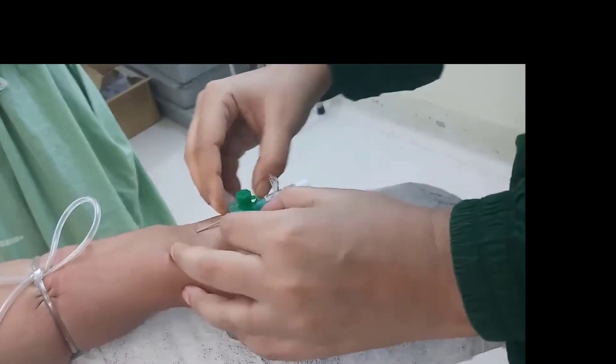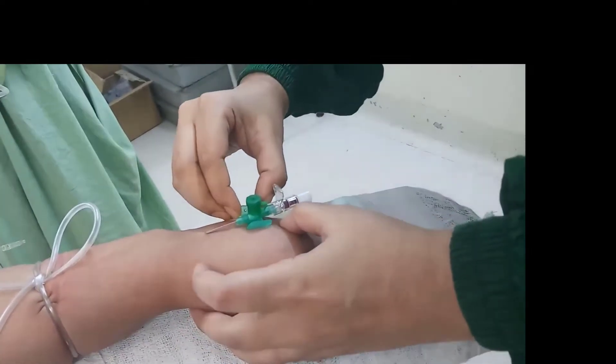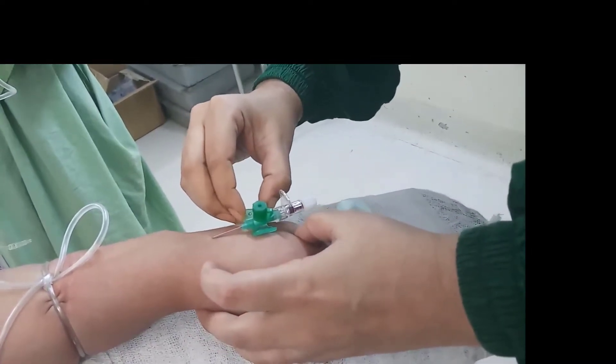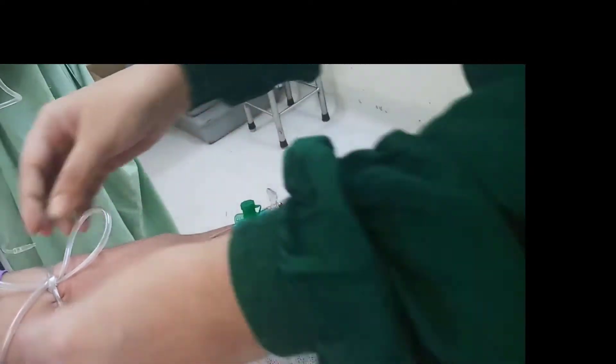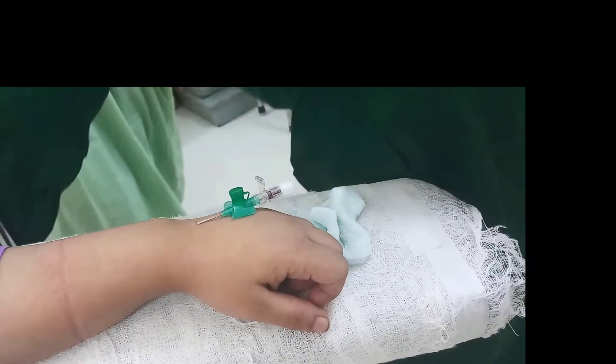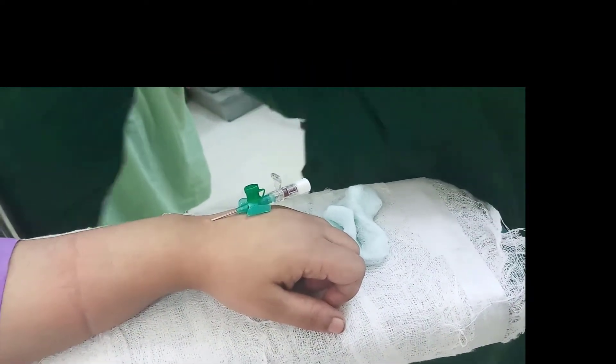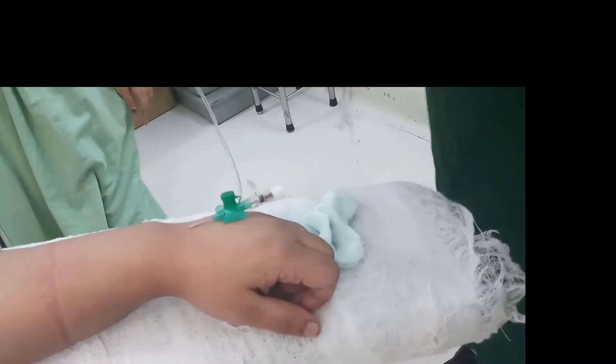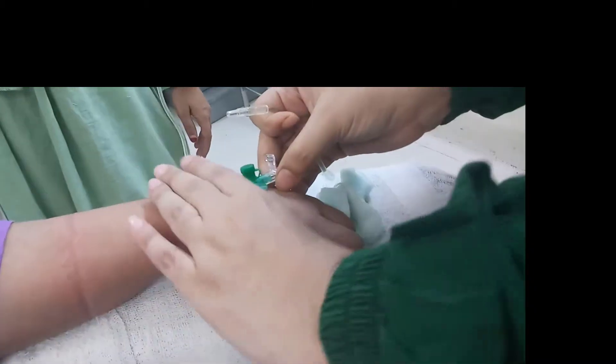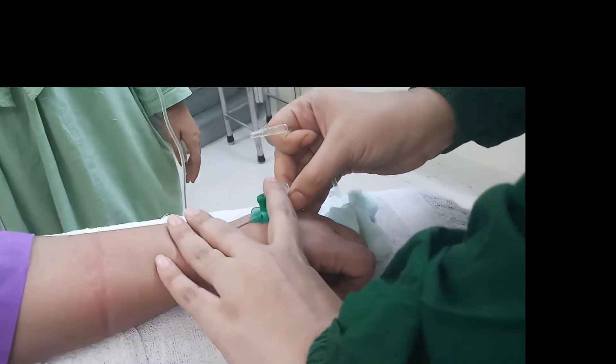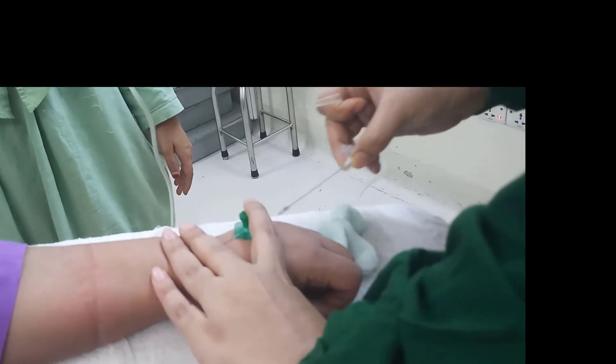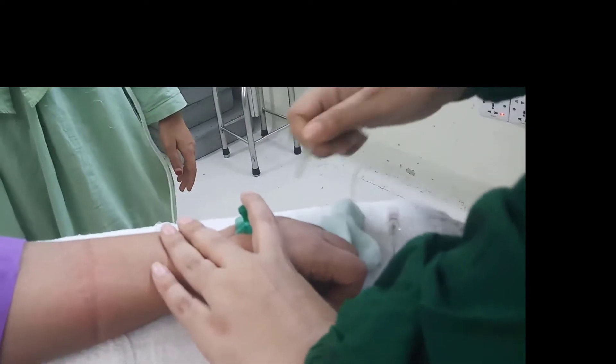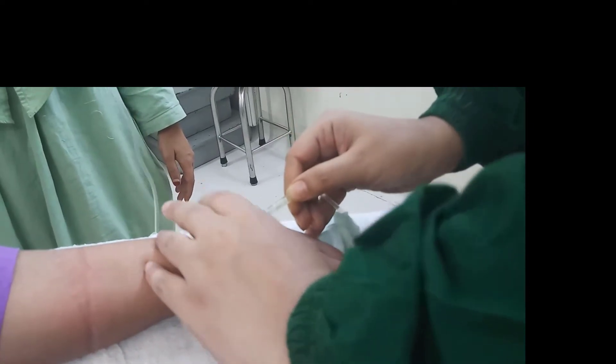After introduction of the cannula, the tourniquet is removed and the trocar of the cannula is also removed and kept in place. Then the channel is attached with the cannula.